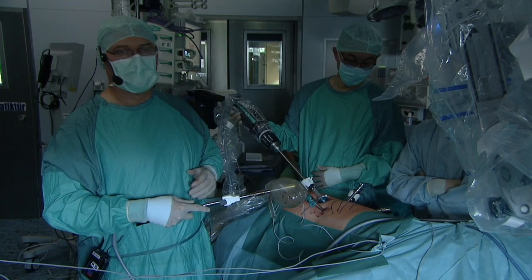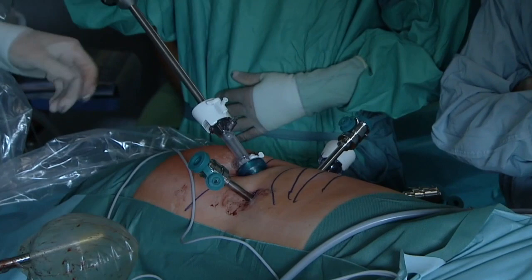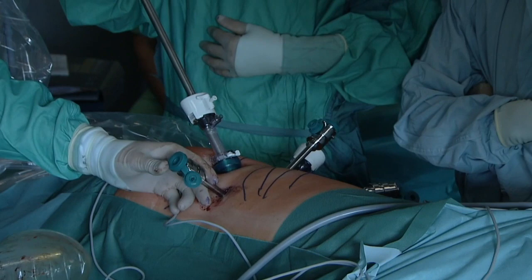So we put our balloon in, we dilated the space, and then once the space is dilated, we put our camera port in first. This is a Hassan-type cannula, a Hassan with a balloon on the inside, and this is a zero-degree scope. The first port I put in after the camera is my posterior port underneath the 12th rib, this port here.